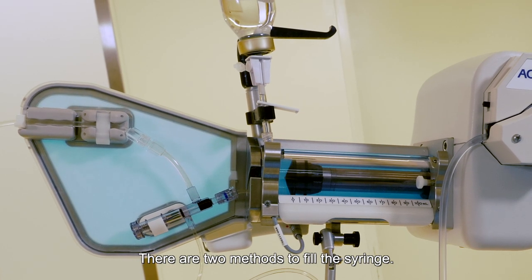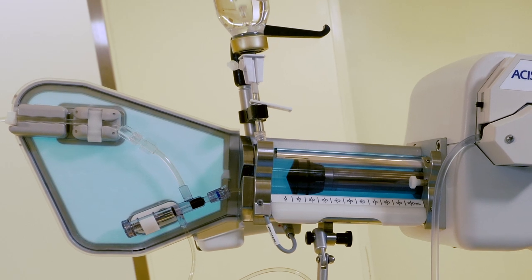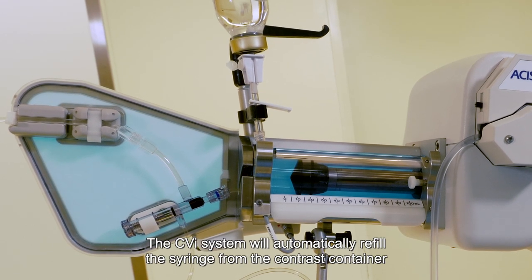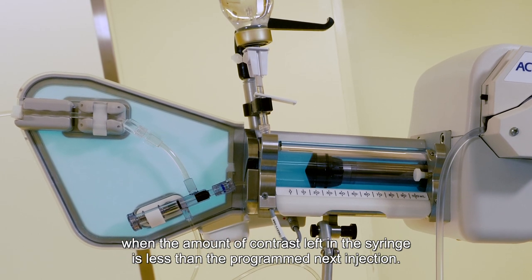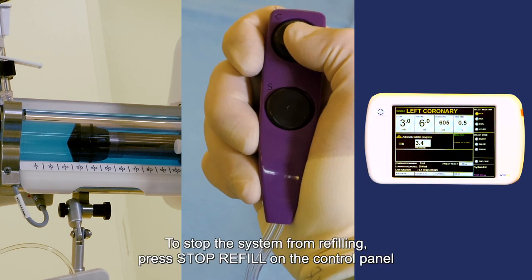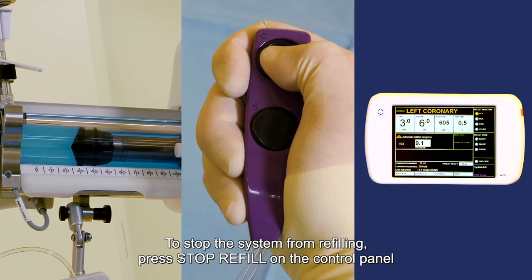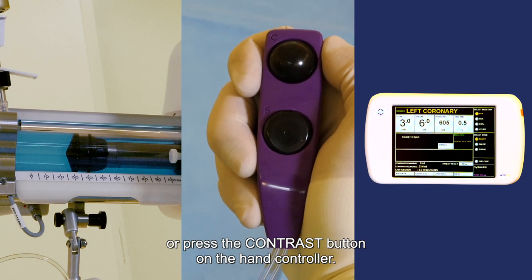There are two methods to fill the syringe: automatic and manual. The CVi system will automatically fill the syringe from the contrast container when the amount of contrast left in the syringe is less than the programmed next injection. To stop the system from refilling, press Stop Refill on the control panel or press the contrast button on the hand controller.